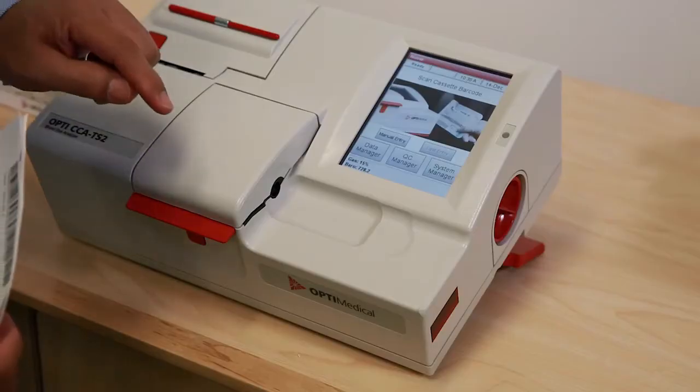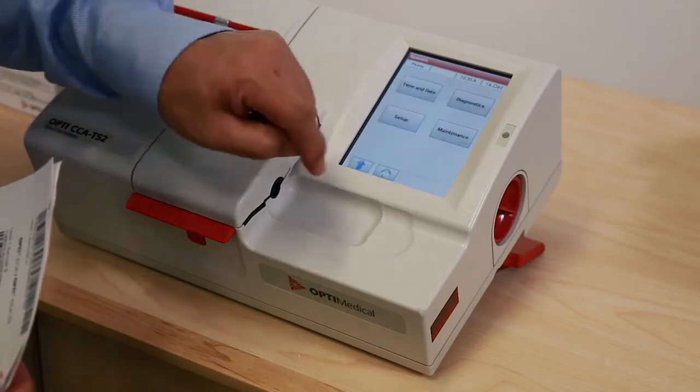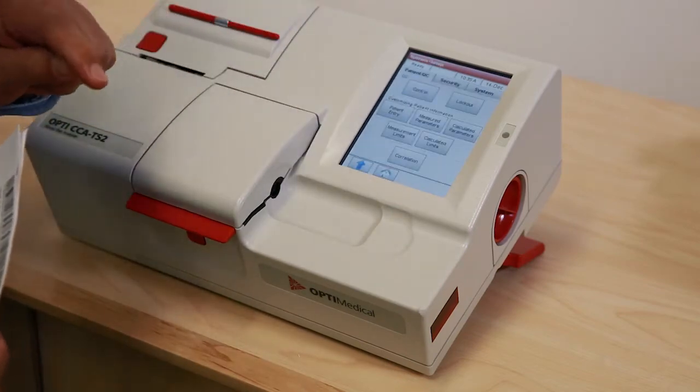To program into the analyzer, go to System Manager, then Setup, and select Control.